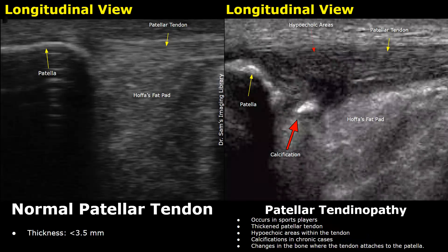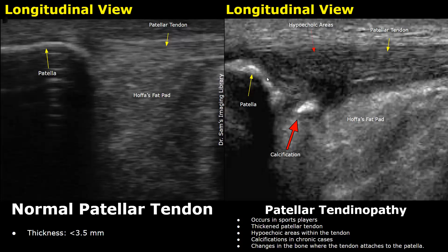This is another chronic case of tendinopathy with a calcification. Another feature seen in chronic cases is changes in the patellar bone where the tendon attaches to the patella — you can see the bone surface is rough and irregular, whereas in the normal image the surface of the patella is smooth.